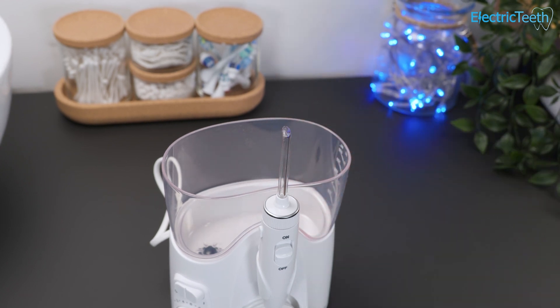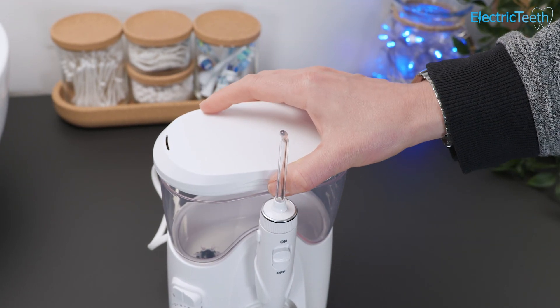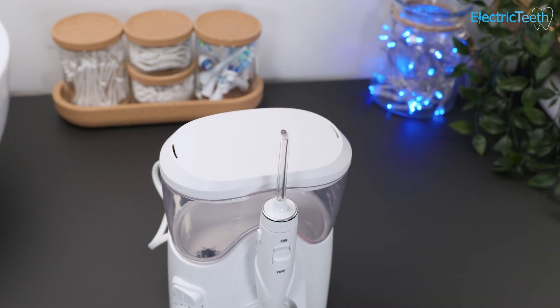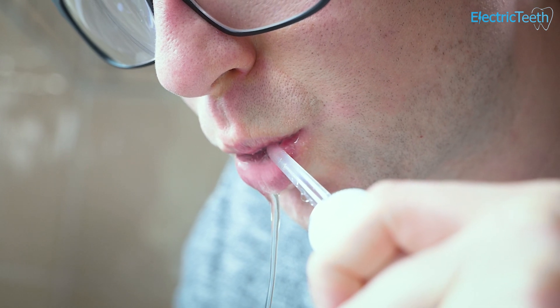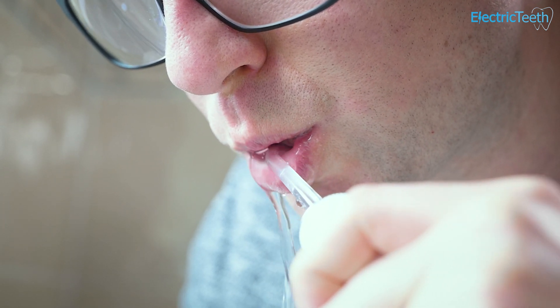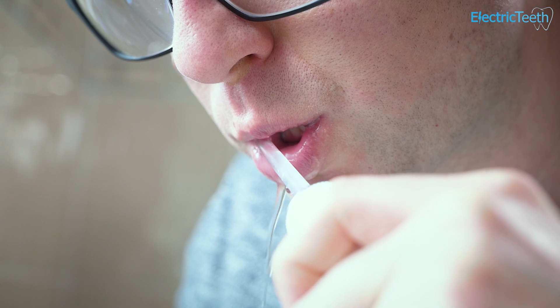For some people you can floss or clean in between the teeth in just 45 seconds if you've perfected your technique. The benefit of this water flosser is you're going to get much more usage time. You're not going to necessarily run out of water, and for many people you'll actually be able to get a couple of flossing sessions from a full tank so you don't have to refill it every time.